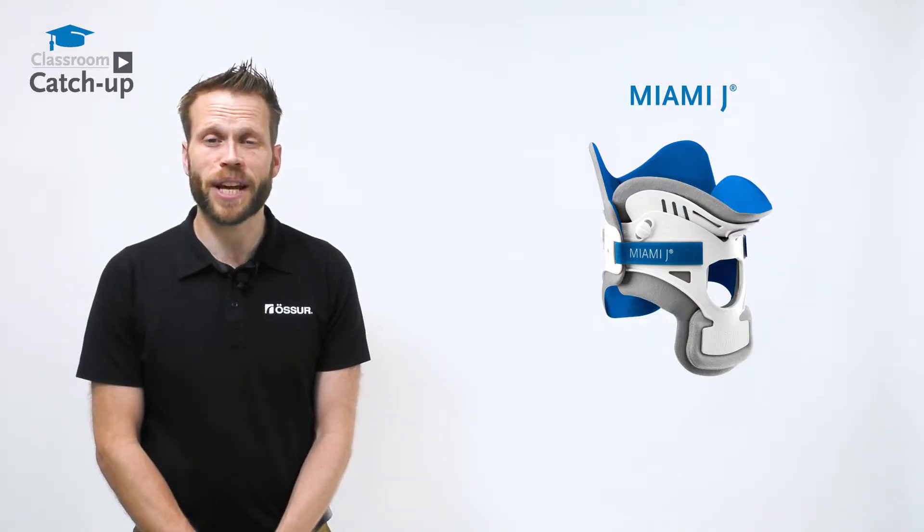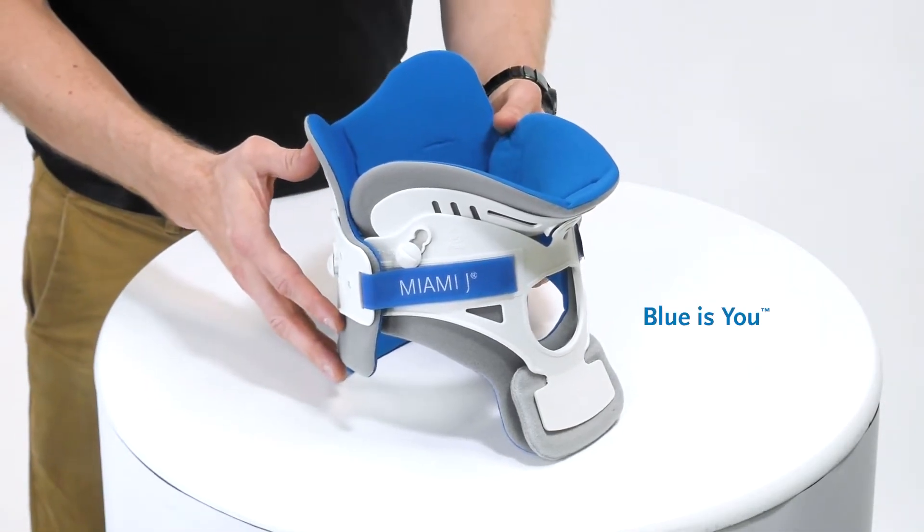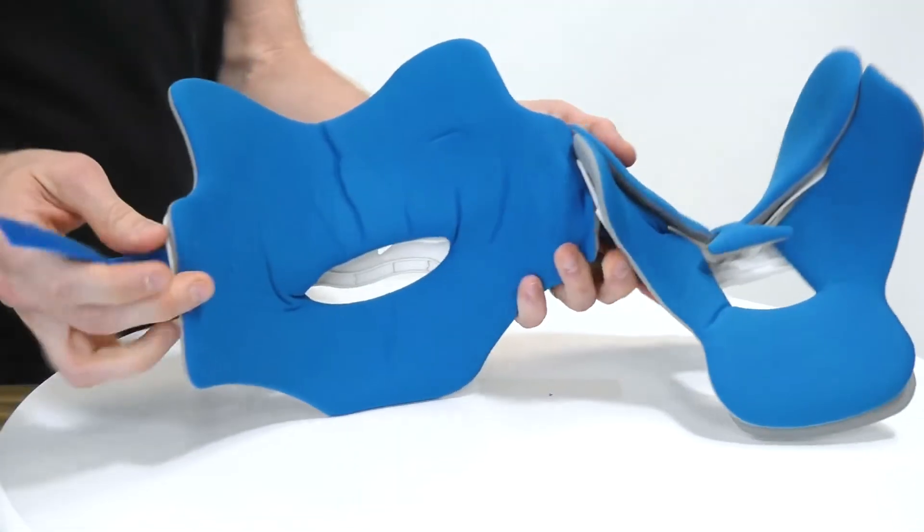There have been some changes to the Miami J, so I'm going to quickly talk you through these. We now utilize the Blue is You functionality, which uses this blue colour ring in order to highlight the patient touch points.